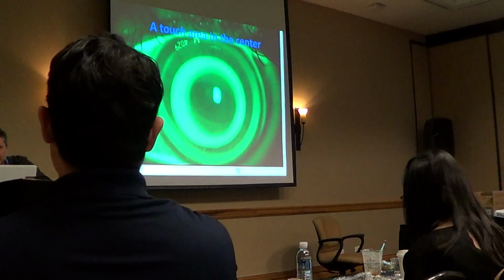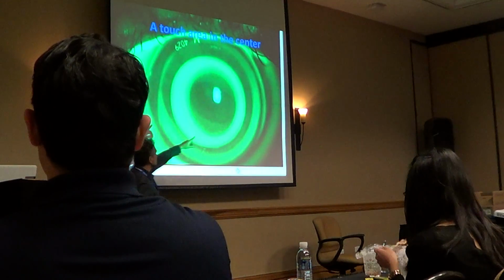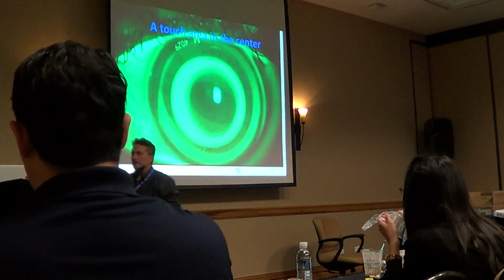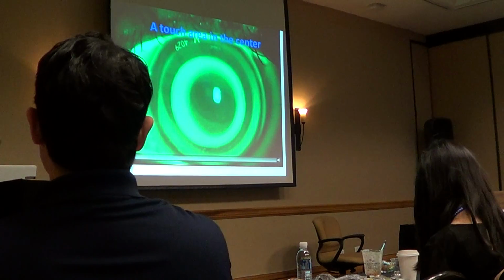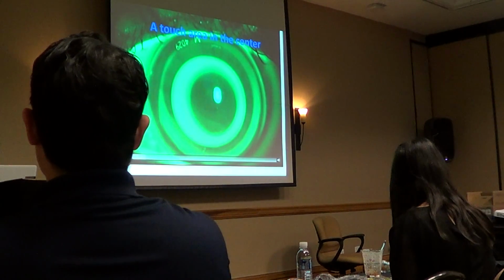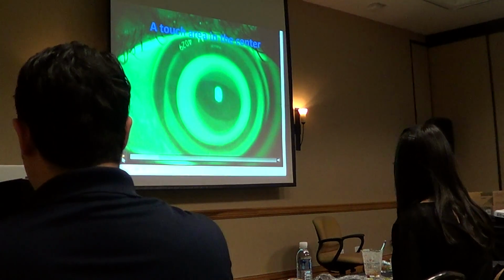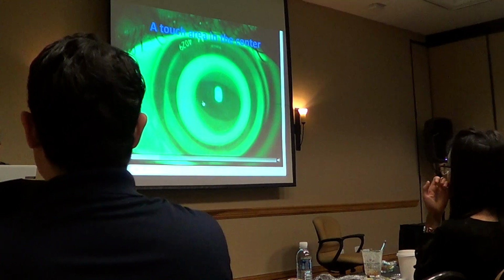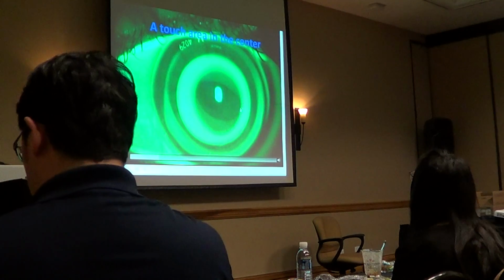Okay, you see the zone? It is not just after the blink. Okay? After the blink, you should look at this area, oval area for a toric cornea.